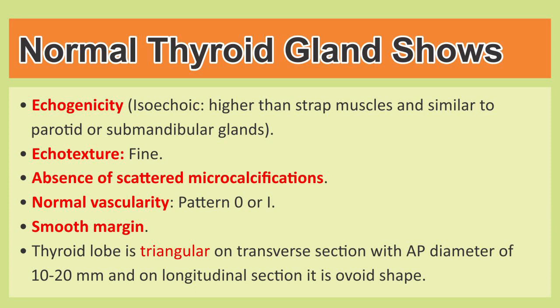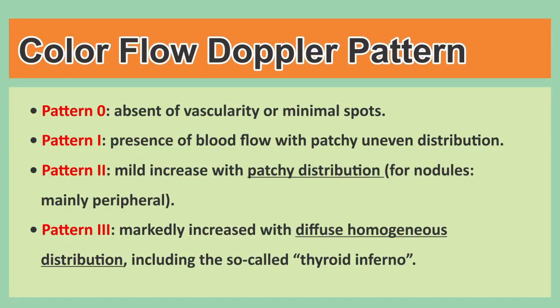Each lobe of the thyroid gland is triangular on transverse section, and its anteroposterior diameter is approximately 10 to 20 millimeters. On longitudinal section, it is ovoid in shape.